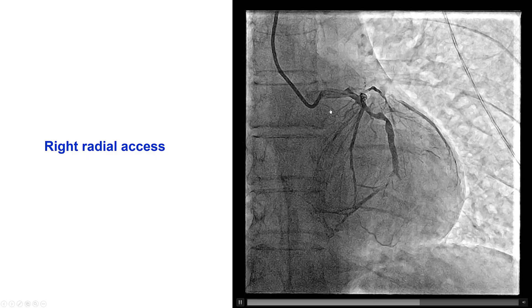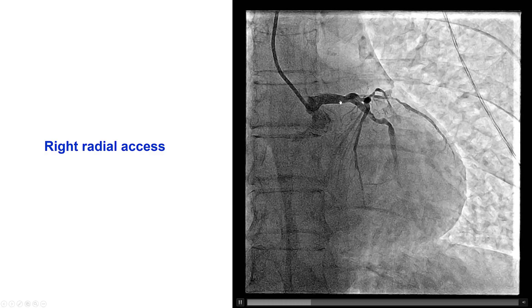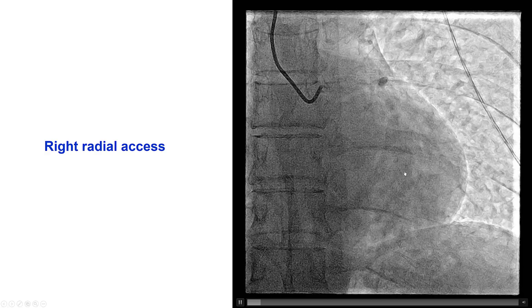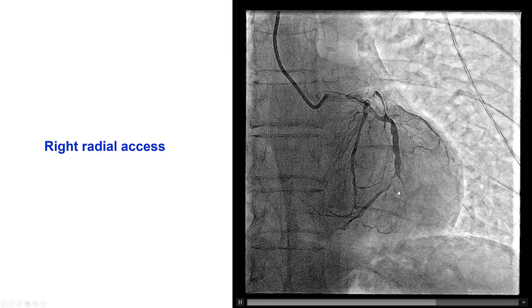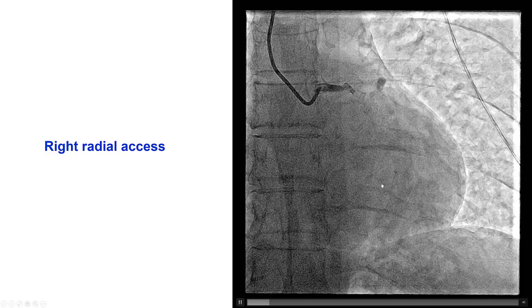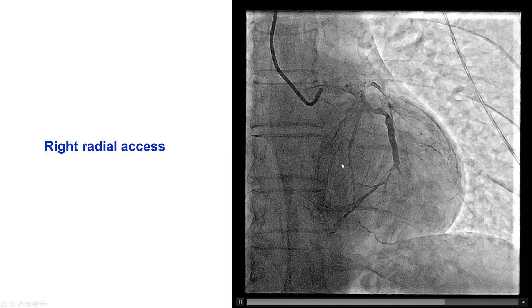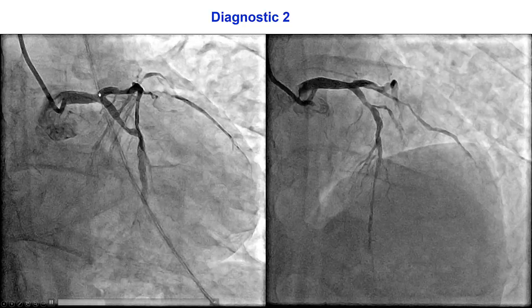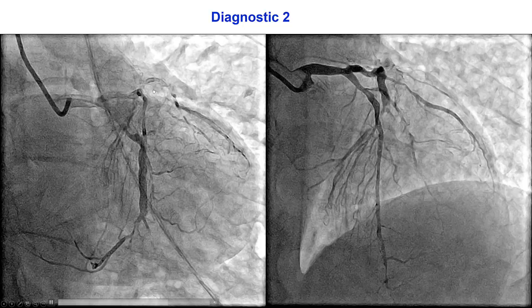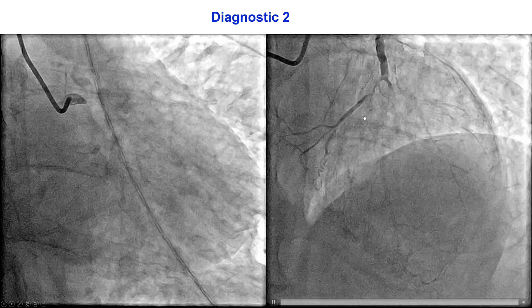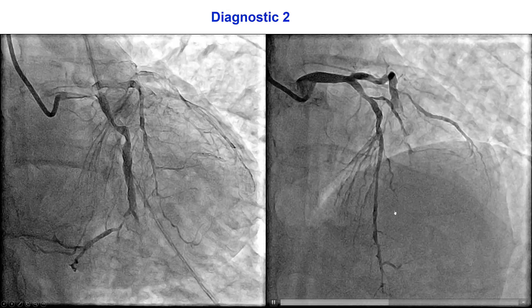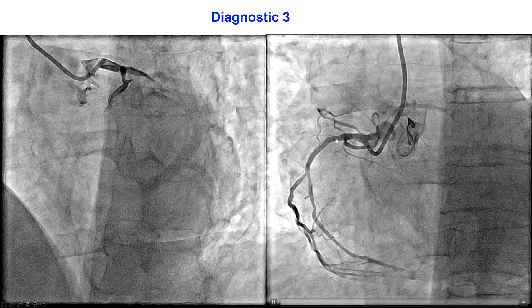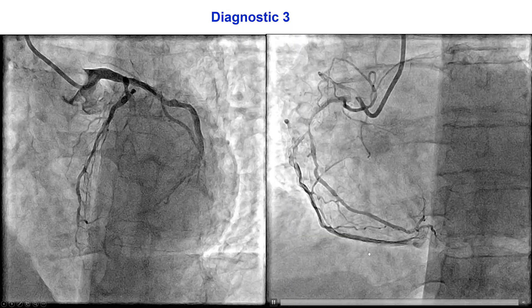This is the initial angiogram from radial access. The patient does have multivessel coronary artery disease. There is thrombotic occlusion of a second obtuse marginal branch, and there is also thrombus in the distal circumflex. There is a lesion in the more proximal circumflex, probably a CTO in a first OM. There is also significant disease in a ramus branch, diffuse disease into the LAD, and a high-grade lesion in a diagonal that appeared to be chronic. The right coronary artery only had moderate disease.